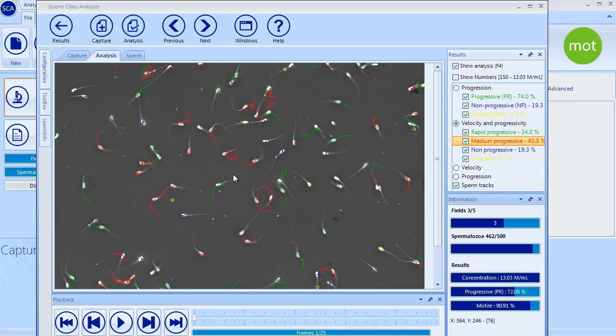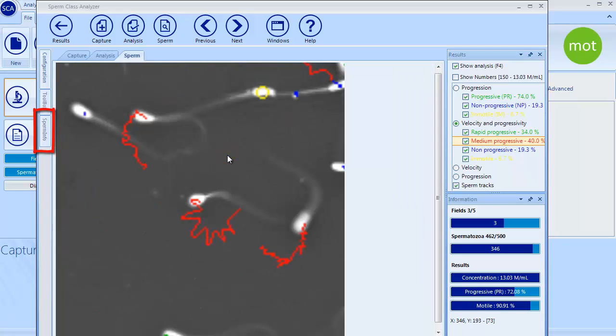It is also possible to see information of a single sperm by double clicking on it and opening Sperm Info tab.